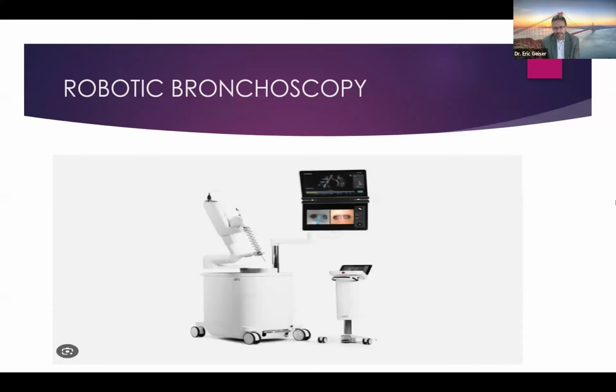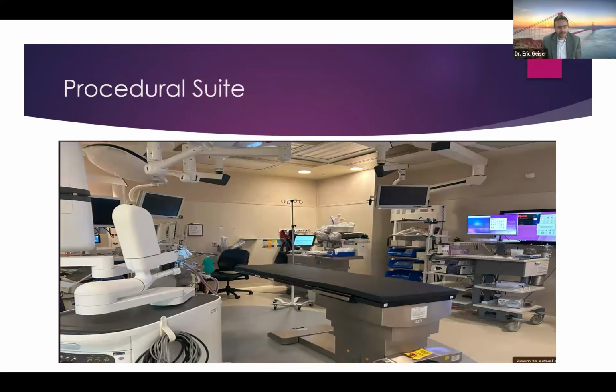So what happens during the procedure is we take your CT scan, we load that into the robot. The physician who's performing the procedure sits at this console and uses the robot, which is on this scaffold, as you see, and that gets advanced into your airway. Here at Trinity Health Grand Rapids, we were really fortunate that in terms of pulmonary procedures, we have a dedicated procedural suite. We not only perform our robotic bronchoscopies in this suite, but also our more traditional bronchoscopies with the help of our team.